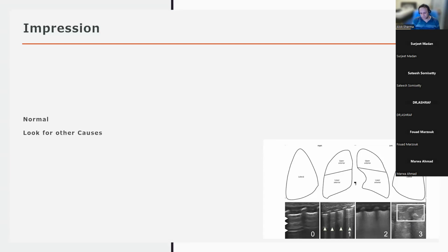And what is the extended score you were talking about? So the extended score is a score that's been developed by Zmanski. I'll talk about it next time, when we look at the cases. There's a score by Zmanski, a score by Fanjul. These are the two posterior scores, and again, a lung ultrasound score by Pang. These are the three regions' studies that have used comprehensive or posterior lung ultrasound scores.